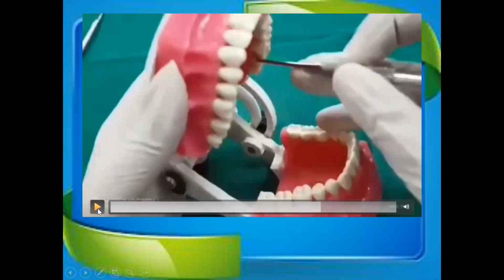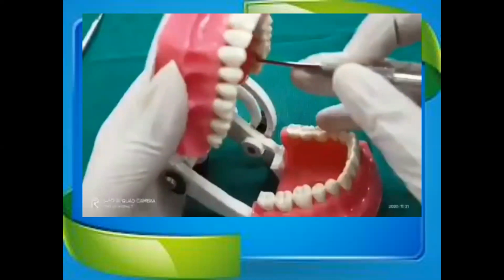Appreciate the opposite arch finger rest. The finger rest is established on the tooth surface on the opposite arch. Like in this case, we are doing instrumentation on the palatal region while the finger rest is on the mandibular arch.